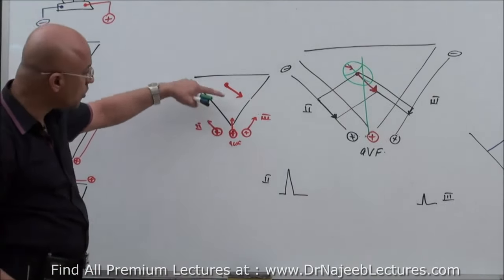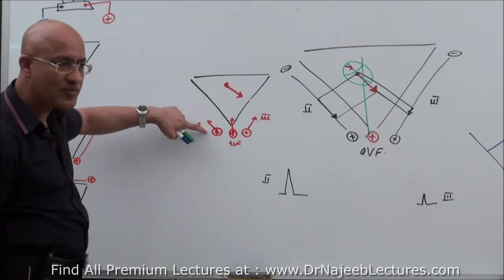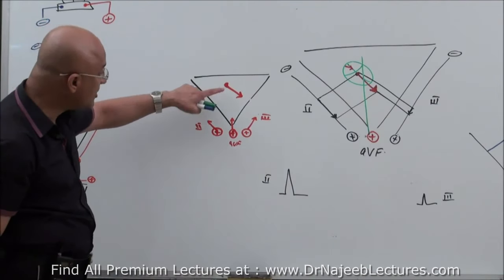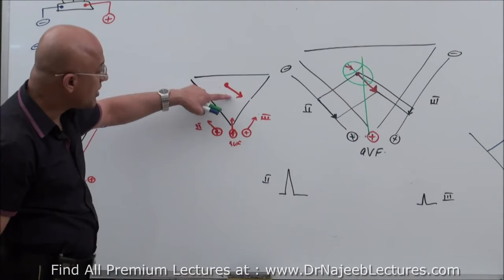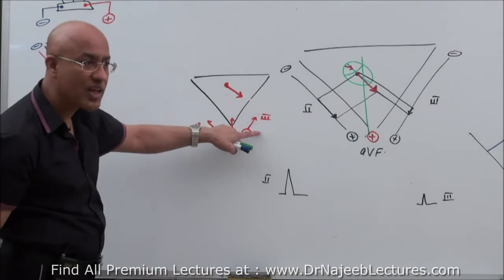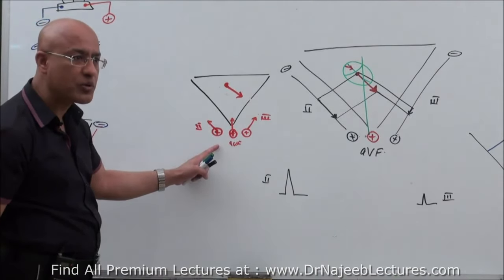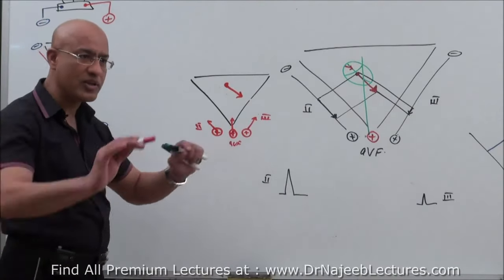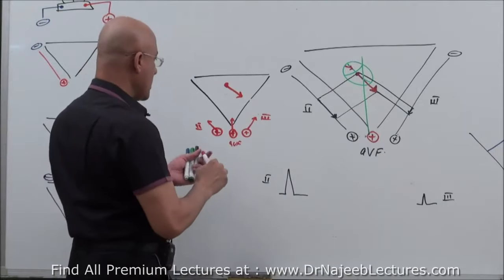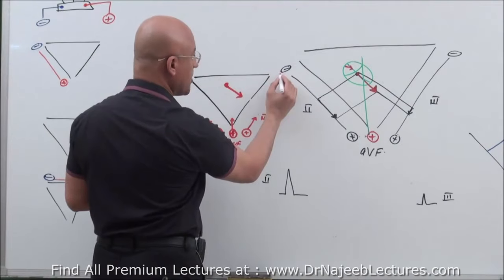But because the vector is most parallel with lead number 2, it will have the best QRS deflection. And this vector is least parallel with lead number 3, so it will have the least deflection. And because AVF is in between, its deflection will be less than lead number 2 and more than lead number 3. Am I clear? Yes. Sure. Now we come to another thing. Here was lead number 1, you remember?